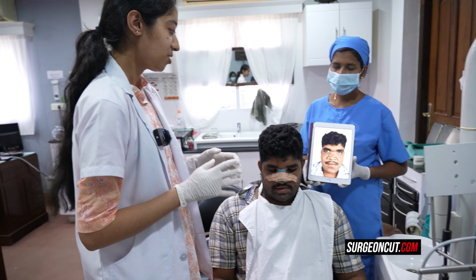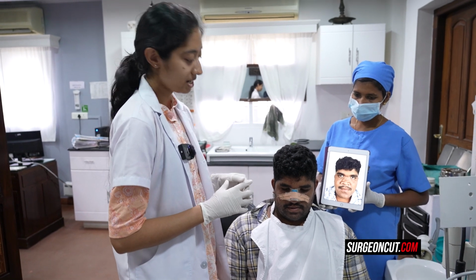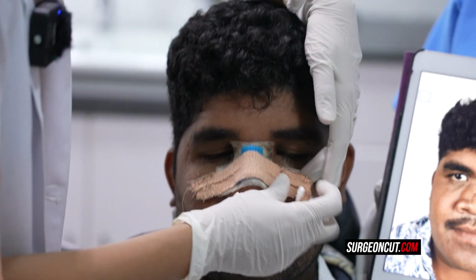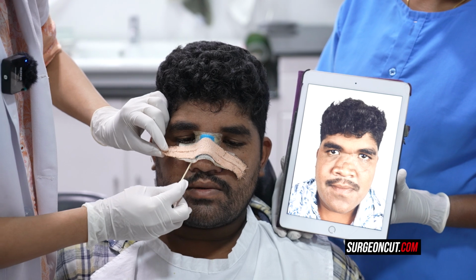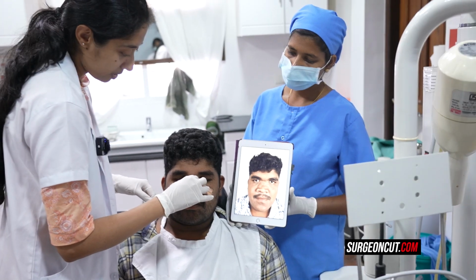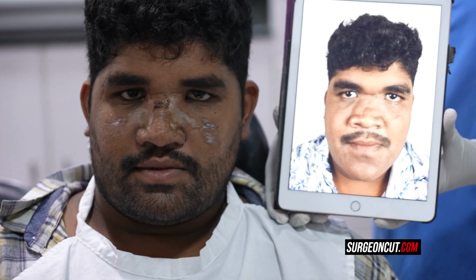Hello everyone, here we are post-operative, a little more than a week, almost 10 days over, for this very challenging post-traumatic rhinoplasty. I'll go on to explain how Dr. Richardson devised a treatment plan for him, but firstly we'll proceed with splint removal. A rib graft was needed for him because that was very much required considering it was post-traumatic. He had an accident about 4 years back, that's what he says, and also had a surgery prior to this. Okay, he does have a little bit of swelling and some incrustations that we will clean now.